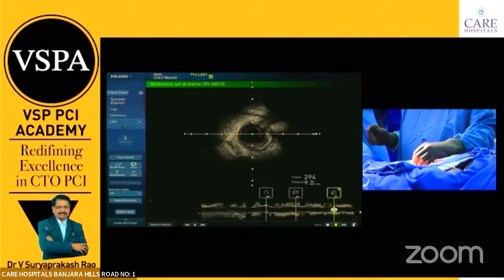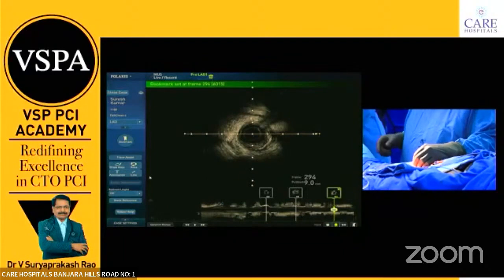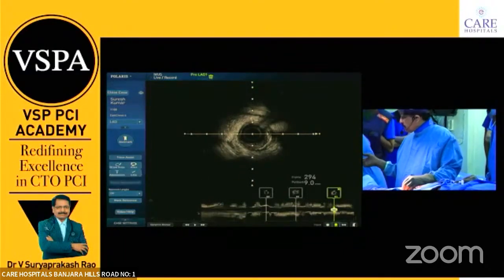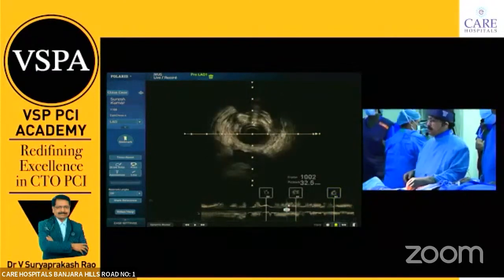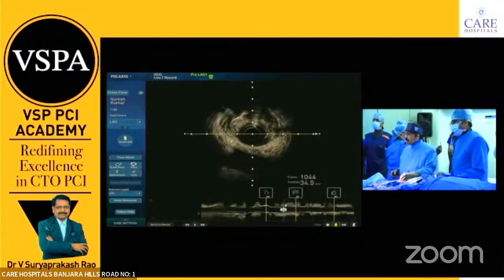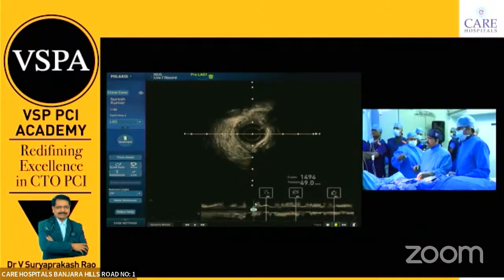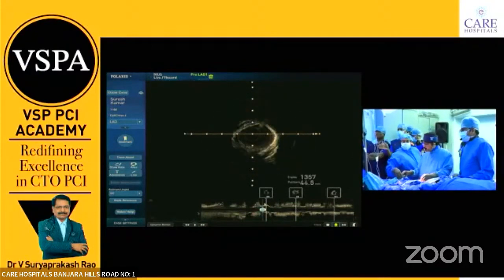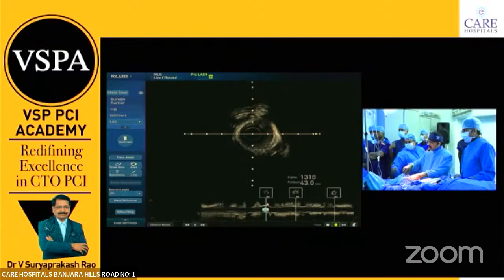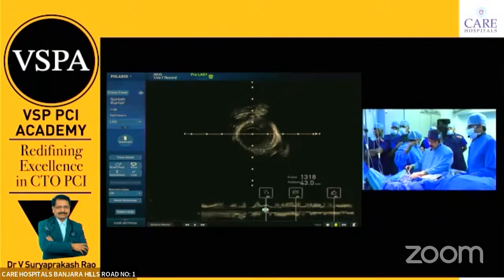We give some NTG in these cases before doing the IVUS, sometimes, to get the correct sizing. Give some NTG, then I will take a shot and see. What is the proximal size? Does it need any debulking, anything like a cutting balloon or scoring balloon? Because bed preparation is important in this.